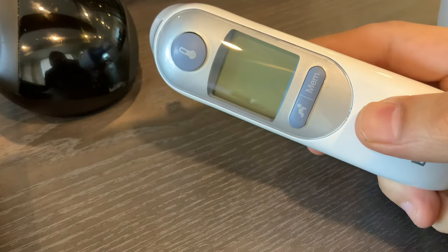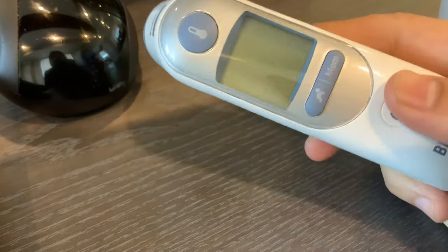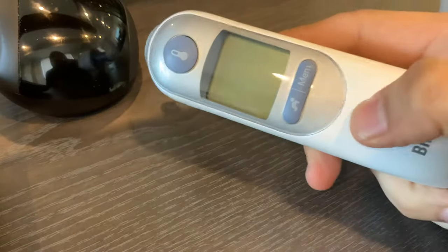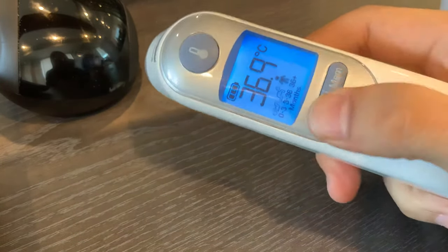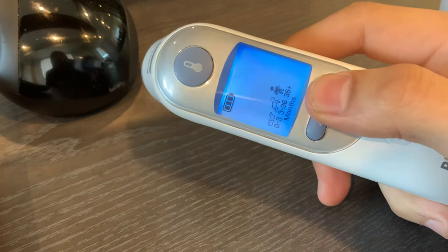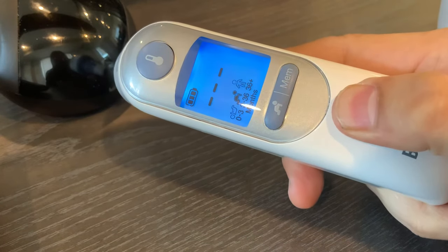Hi Ann, there's a video showing you how to change the temperature from Fahrenheit to Celsius or vice versa. So let's turn this on. When it's on, to change it from Celsius to Fahrenheit or vice versa, you actually have to turn it off first. So I'm gonna turn it off right now.